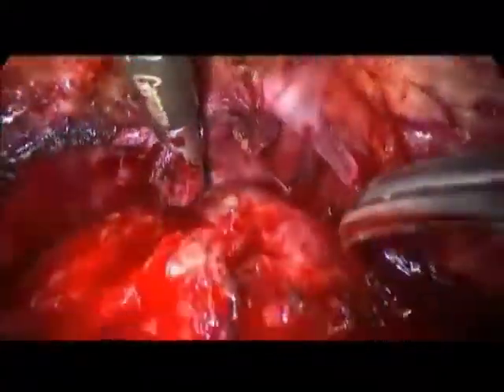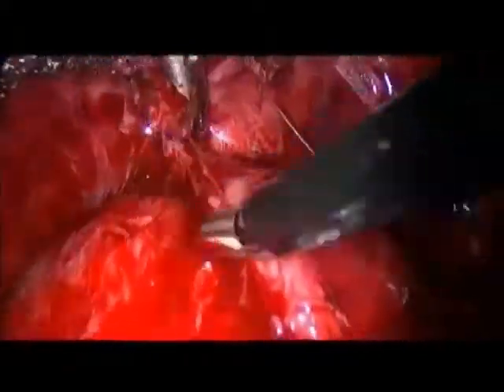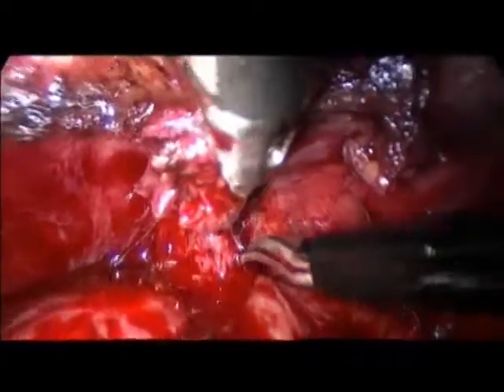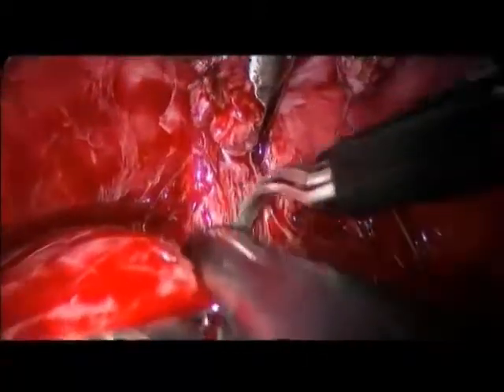On its caudal attachment, and logically, we will keep on making it free on this axis when we will proceed with the bladder neck just thereafter. But before this, we need to complete the maneuver on the caudal side of this commissura and place the stitch. What we have here in direct view are the pillars of the urethra on each side and the urethra itself on the midline. Still intact, as you can see. So we will now first clean the lens and then place the stitch.